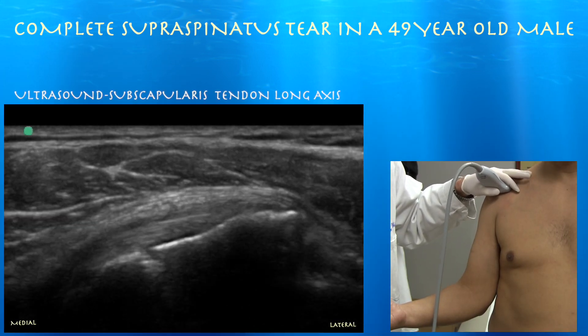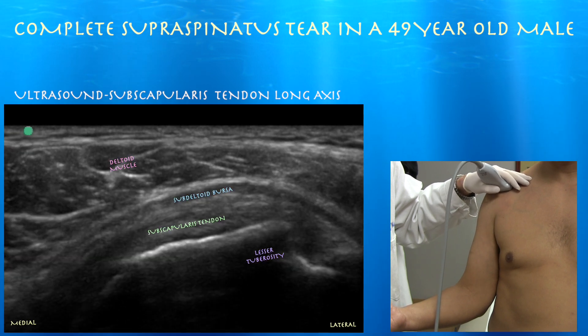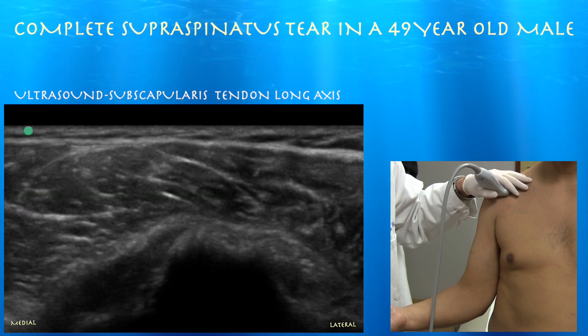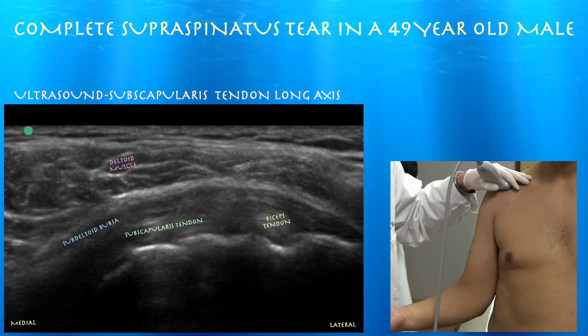This is long-axis subscapularis tendon. Left side of the screen is medial. Here you can see an essentially intact subscapularis tendon attaching on the lesser tuberosity. It looks fairly preserved. You can see it inserting on the lesser tuberosity, and here's the biceps tendon at the superior aspect of the subscapularis tendon.